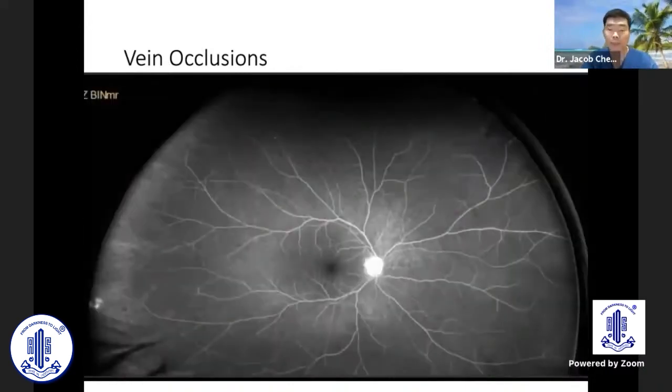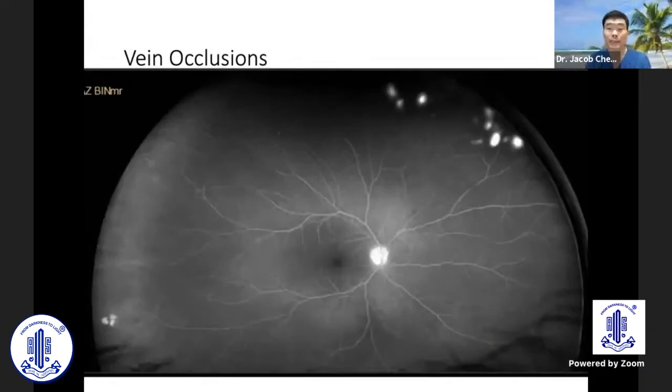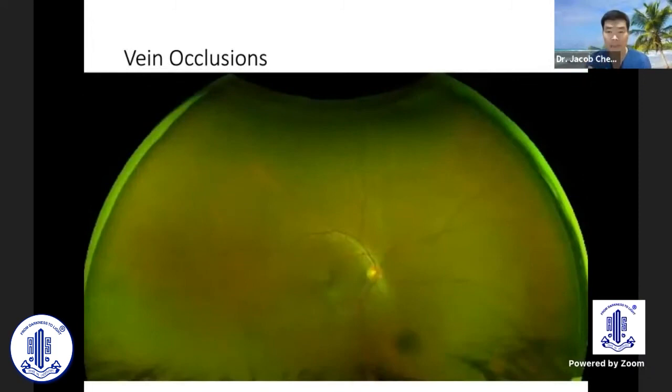Interestingly, this patient's opposite eye, routinely with the help of ultra-wide field, looks like a normal fluorescein angiogram, but you see these light bulbs on the superior part, which you would probably miss. I missed them on clinical examination, and this swings the diagnosis, needing further investigation of this patient's right eye.